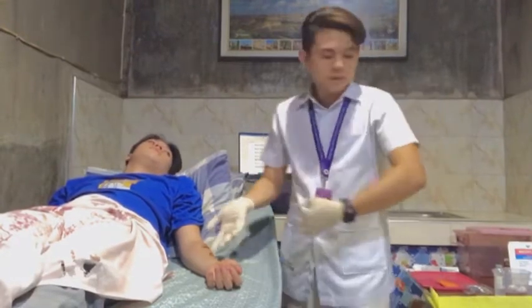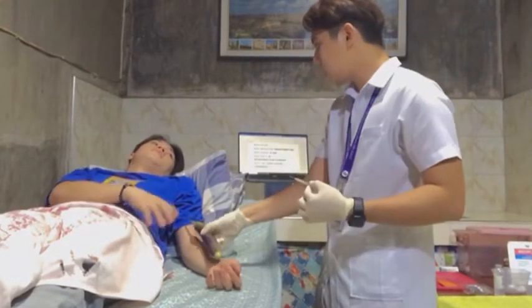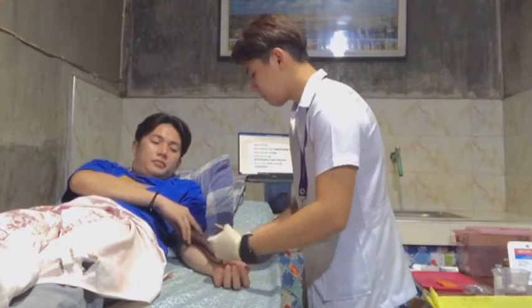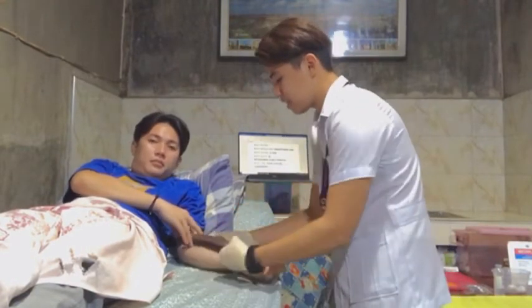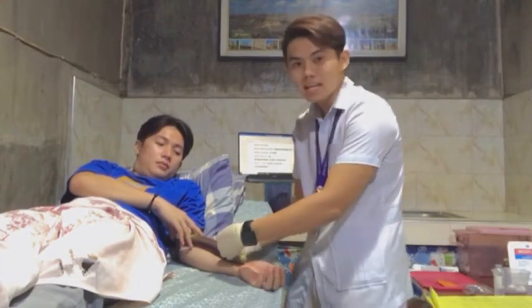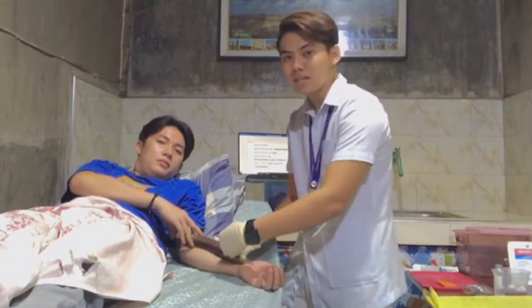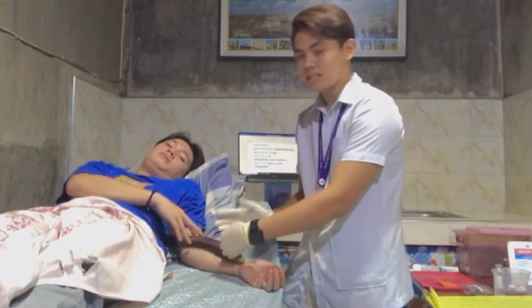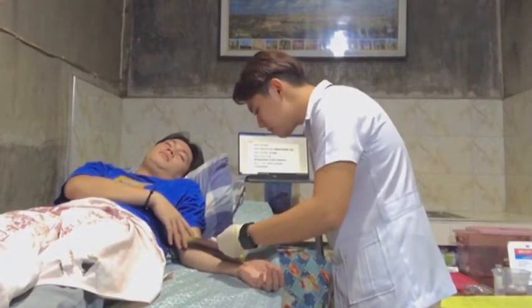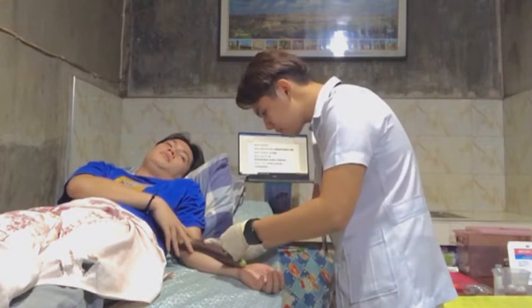So of course we will be demonstrating this one with an eggplant. Sir, can you please hold this one? Are you comfortable? So it will be like this, the position. Of course, we need to slowly inject the medication and feel the resistance until you see a bleb that resembles a mosquito bite that will appear on the patient's skin. I will be injecting now, sir, okay? Of course, do not forget this one.